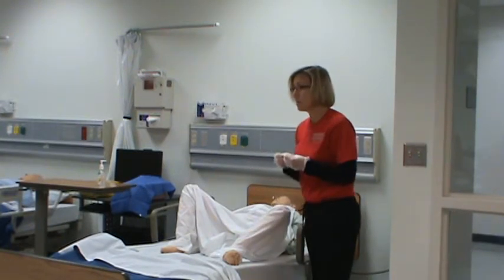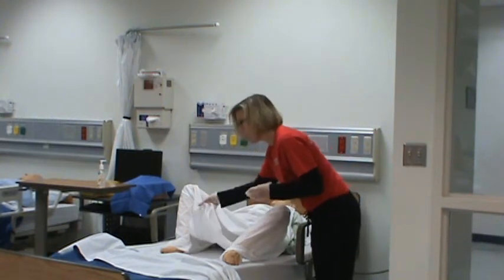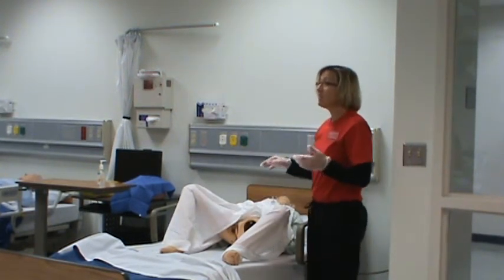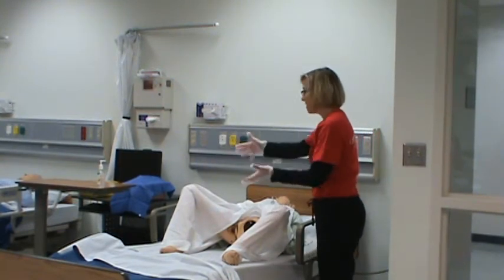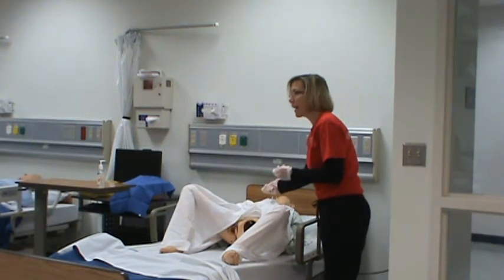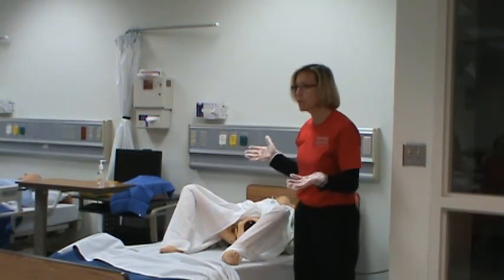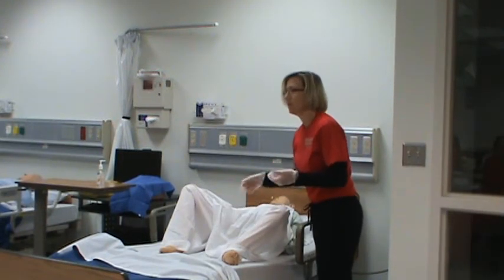So if you've got someone to help you, what would be ideal in the perfect world, then that person, before you move the kit here, can open up the drape and expose the patient. If you're the only one, which chances are you'll be the only one, then this works well until you remove the drape and have him exposed and then start your kit. So they are going to be exposed, but there's nothing you can do when it's only you. But if you had a patient care tech with you, you could give him or her a little more privacy.